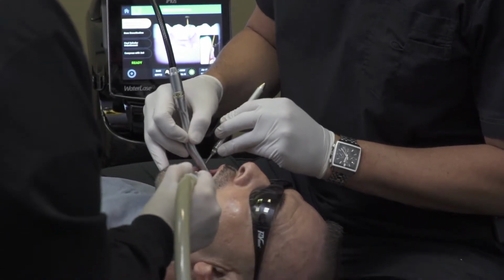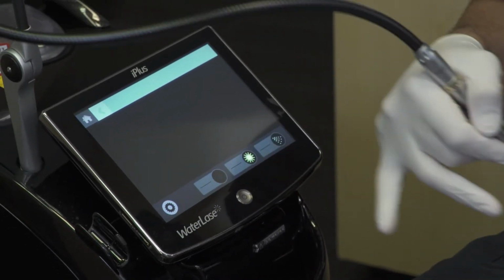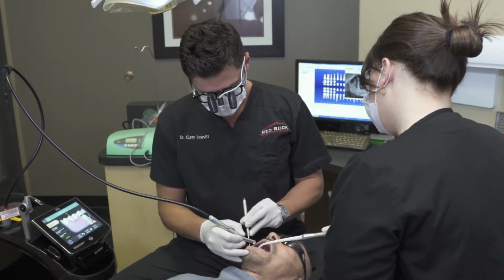Another benefit of utilizing laser therapy is, one, we can treat more teeth at once. So in the past, we've had to do these invasive surgical procedures, whereas one quadrant at a time typically took 4 different procedures in order for the patient's full mouth to be completed. Nowadays, we can do this all in one visit.